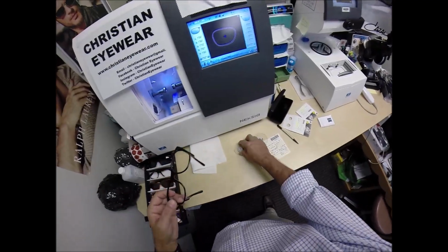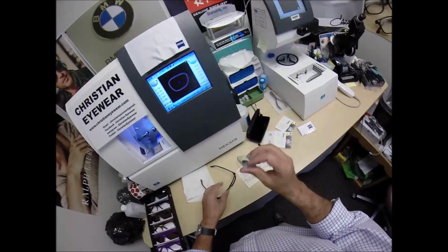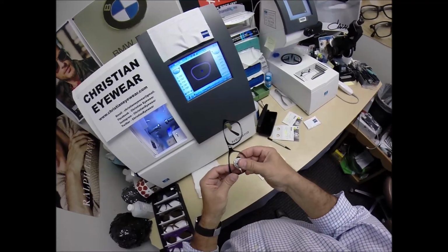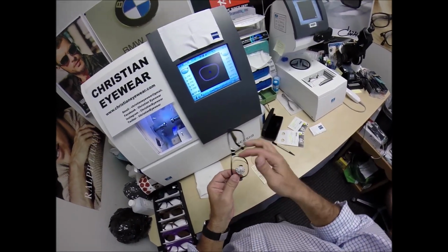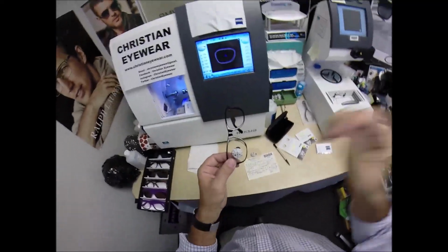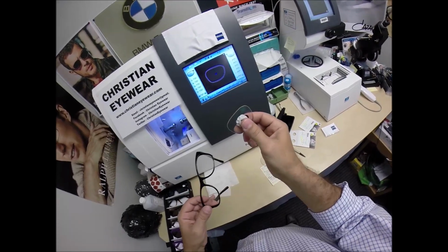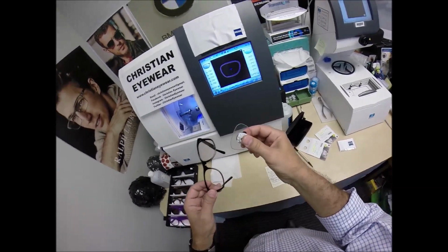So, the reason why I put the safety bevel on the back surface of the lens, I'm going to see if the lens fits in first time around. It's not unusual to have to take it down a little bit more. There's the old carpenter saying, you can always cut more off of a piece of wood. You can never add it back on.